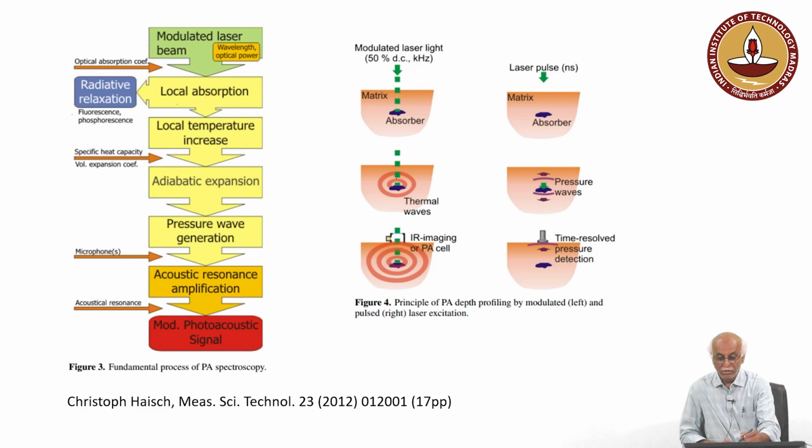Depending upon the absorption, the thermal waves generated are captured. Now, we can also use an infrared approach in order to measure the temperature change, okay, one approach.